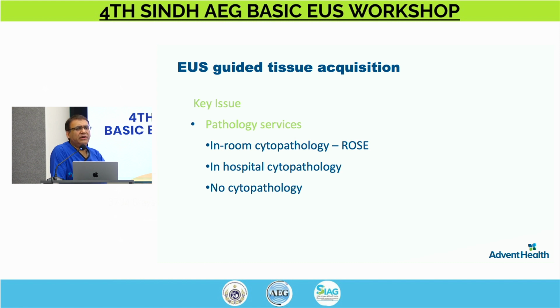Yeah. So that's what I'm saying. You have to look at what resources are available to you. For here, a cytotech is available. Actually, I have two cytotechs in the unit, but in the unit we perform 15 to 20 EUSs every day, so we can afford to have two cytotechs, okay? So here, a cytologist is available to us, two minutes' walk. That's different. Not even in the USA is that available in every unit.